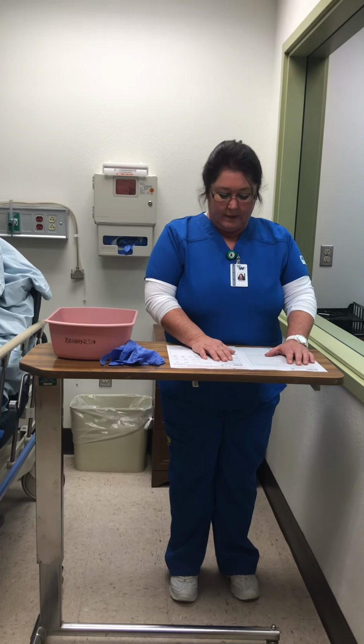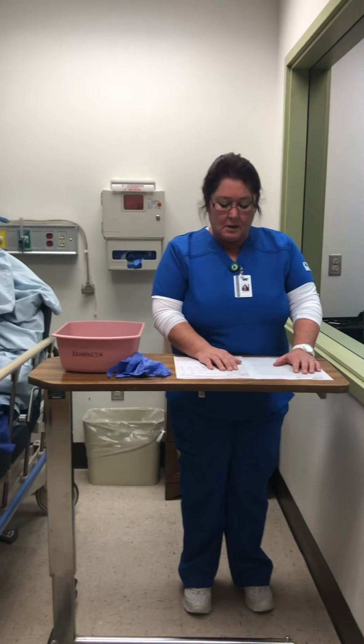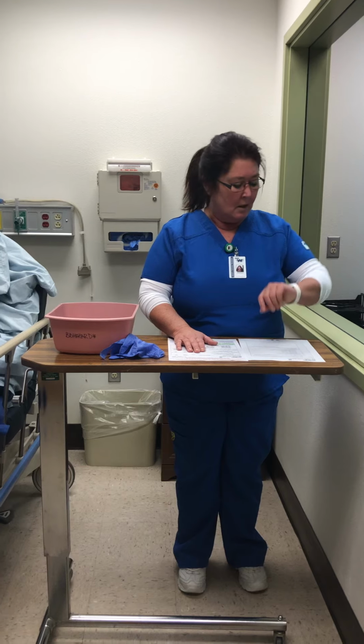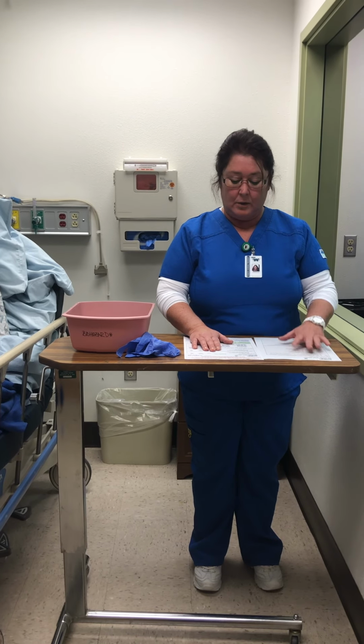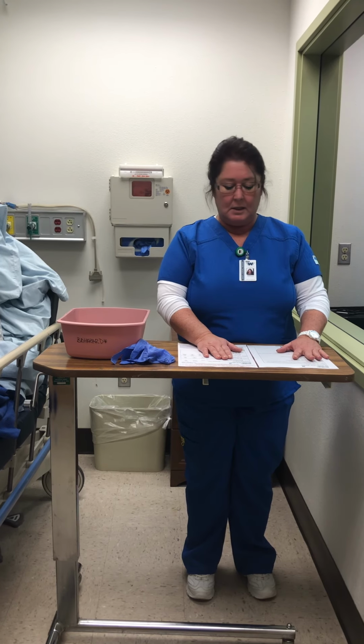And we have Practi NPH insulin U100 15 units subcutaneously daily with supper. It's to be given at 5:30. We are at 5:15, so we're good to go. This insulin has an onset of 90 minutes.